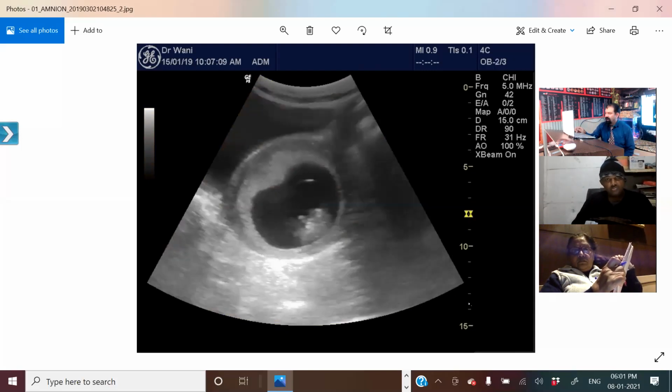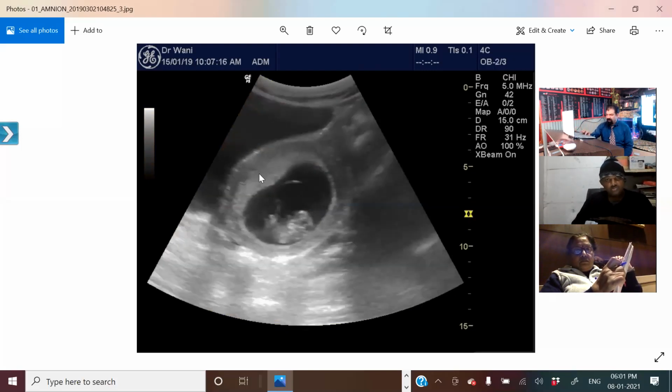Now, yes. What is this over here? First of all, this is the gestational sac over here. This is the gestational sac.